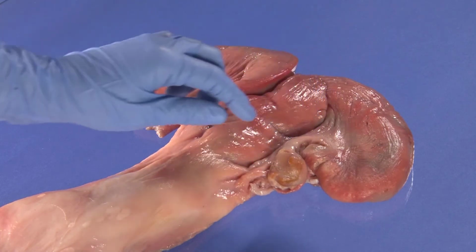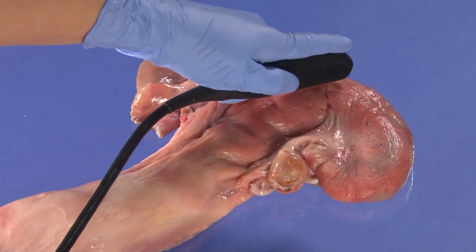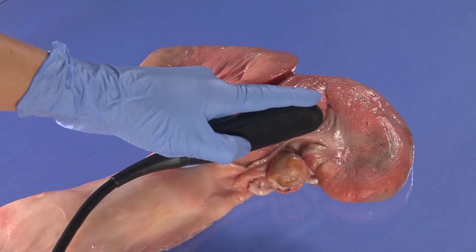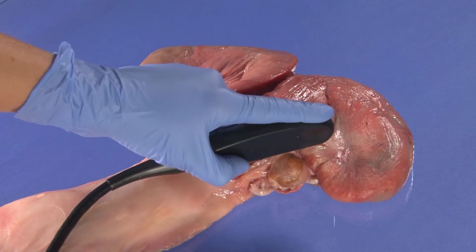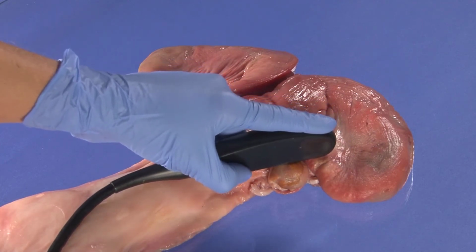For the Doppler ultrasound, retract the uterus and do the first ultrasound examination of the ovaries to identify the CL with the normal mode. When you identify the CL, keep the probe in place and start the Doppler mode.